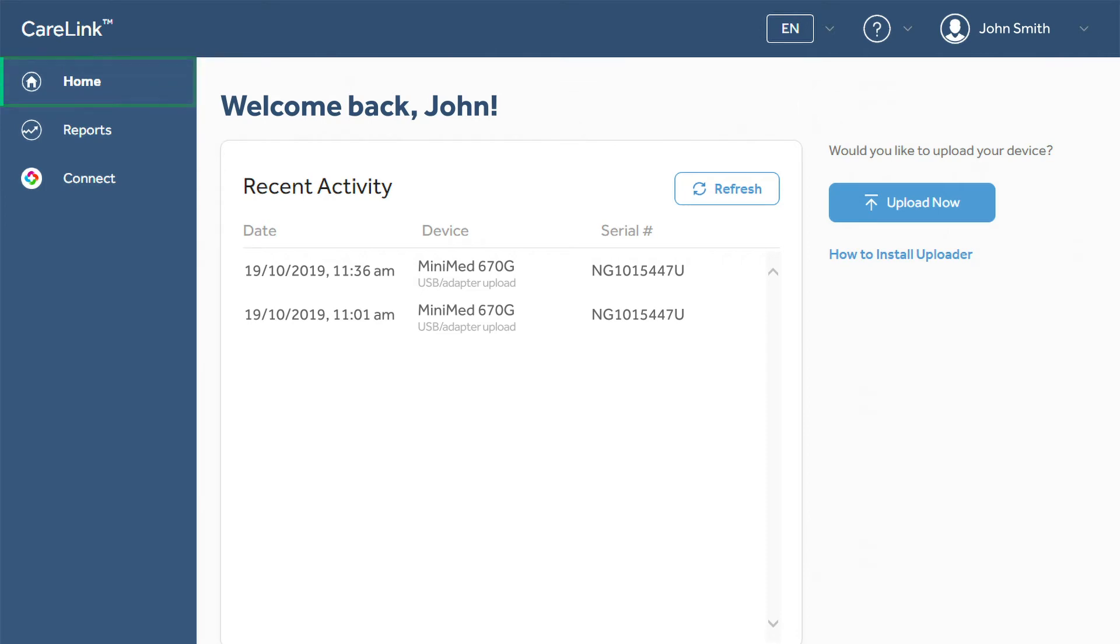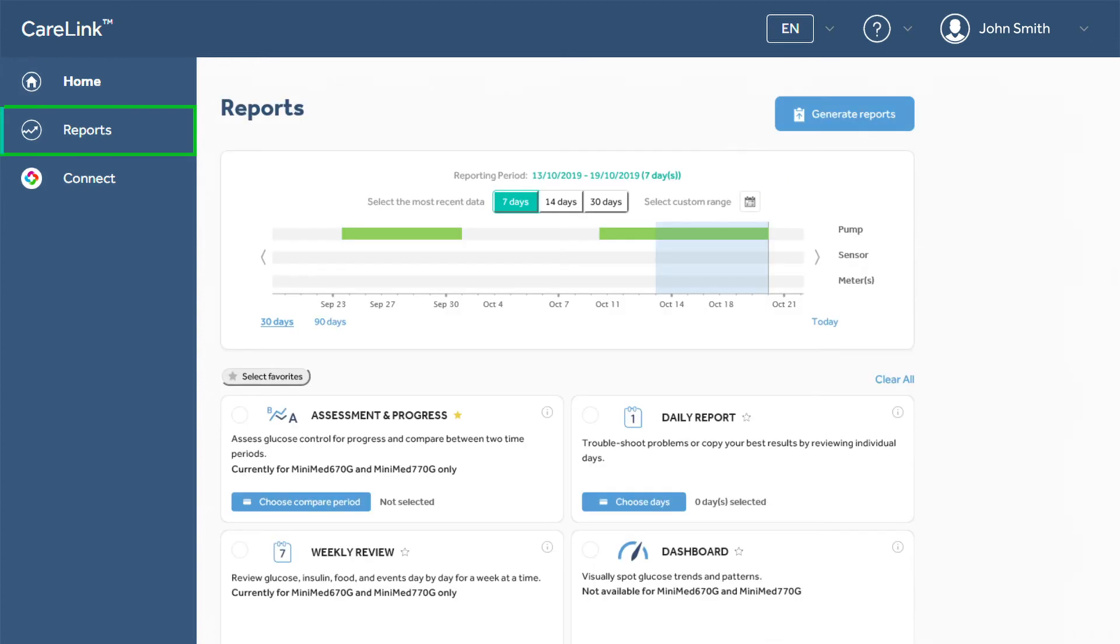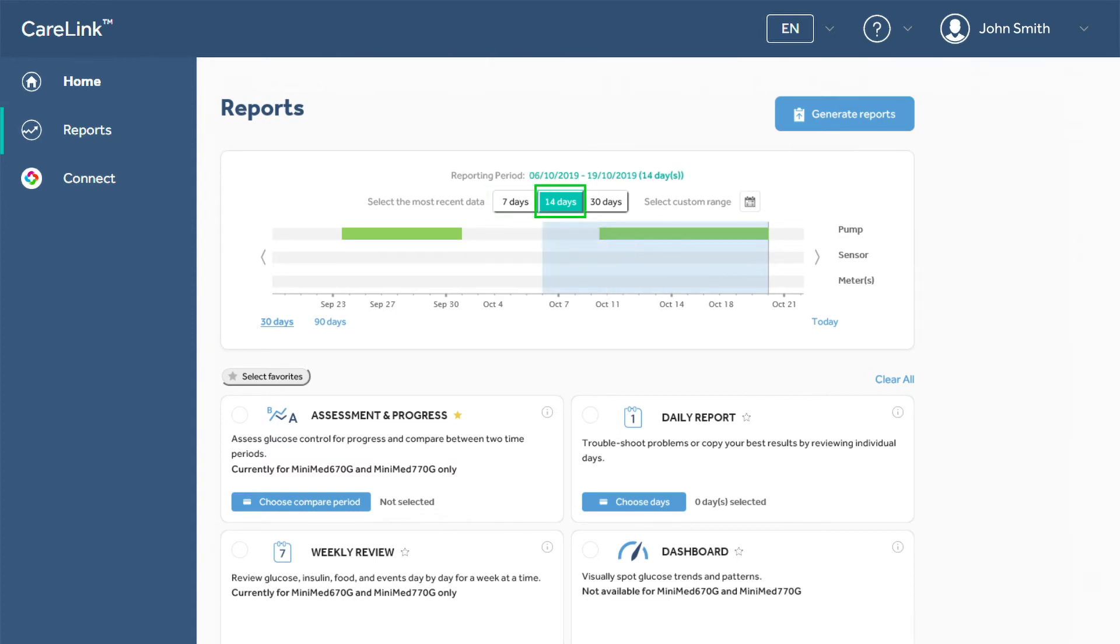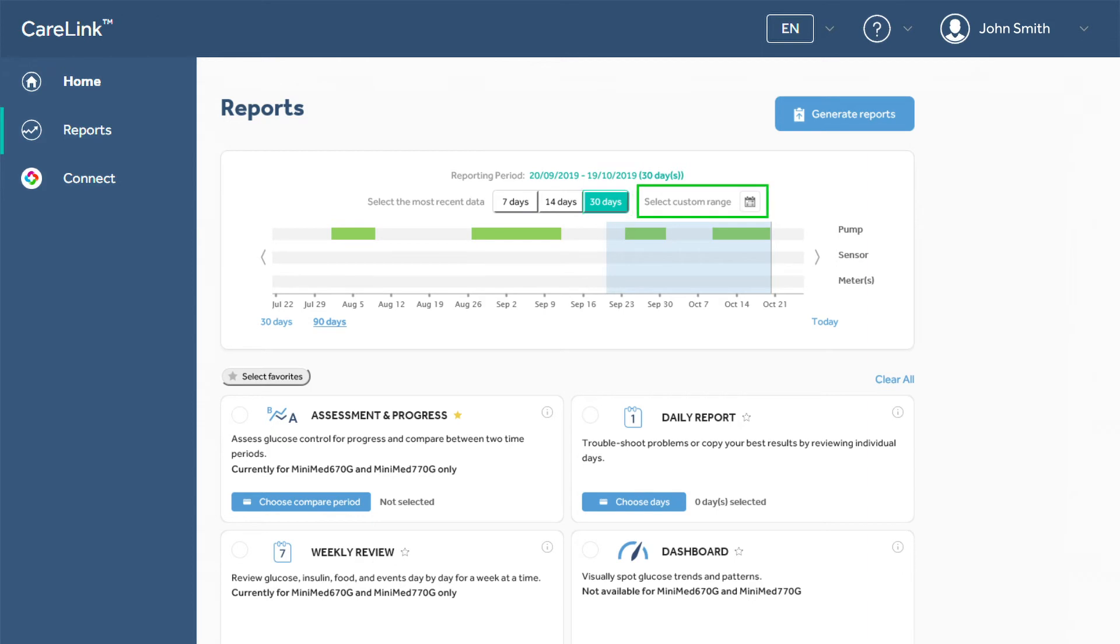After your data has been uploaded from your device, you can select Reports to see your data laid out in charts and graphs. You can create reports for different timeframes such as 7 days, 14 days, 30 days, and a customizable range where you can enter the start and end dates of a range that you would like to view.